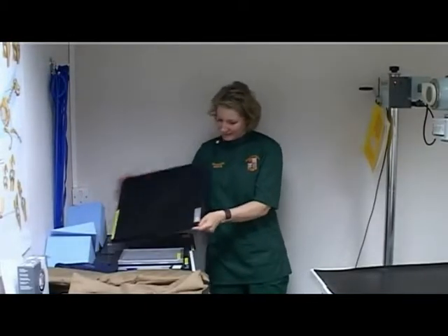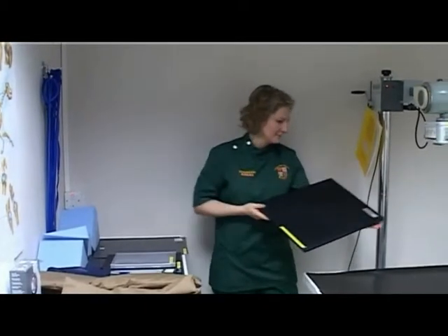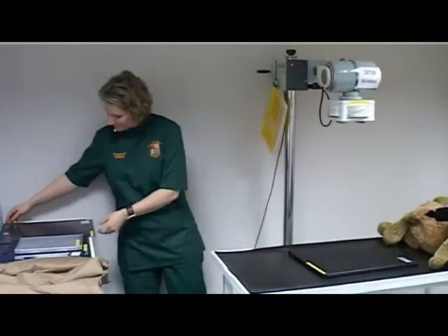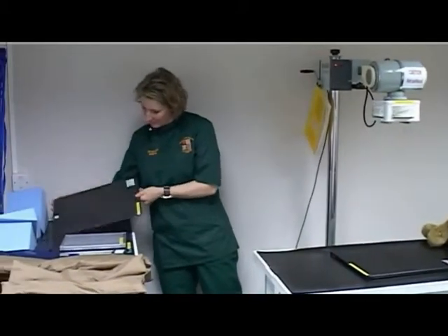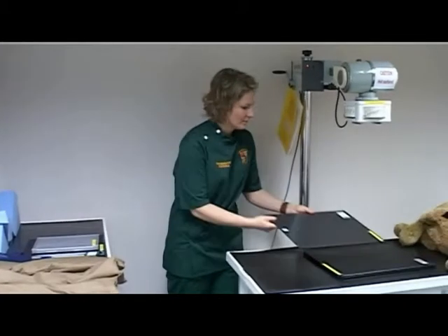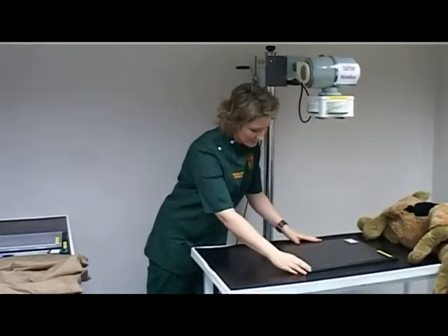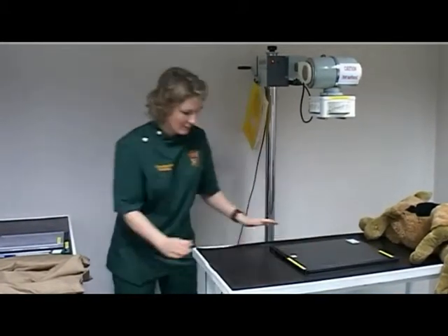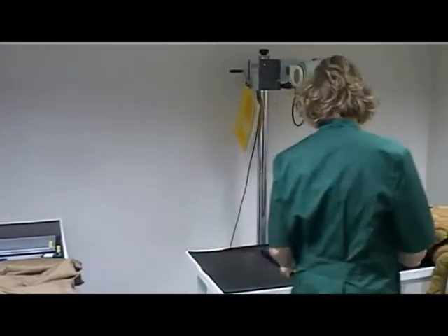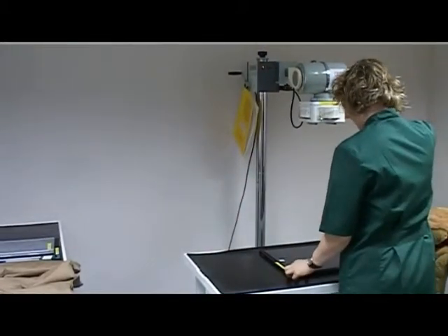Select a large size cassette and place it the correct way up on the table. Select an appropriate size stationary grid and place it exactly on top of the cassette. Ensure it is the correct way up and collimate to within the edges of the grid.